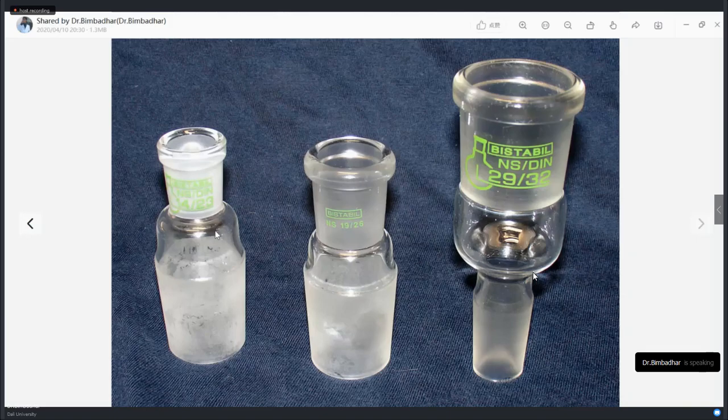This is called ground glass, a glass that has been polished with sandpaper. Or simply speaking, whenever you break a glass, the edges of the glass appear as ground glass itself. So this kind of pattern is called a ground glass opacity.